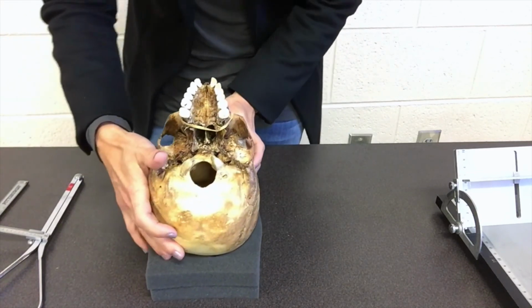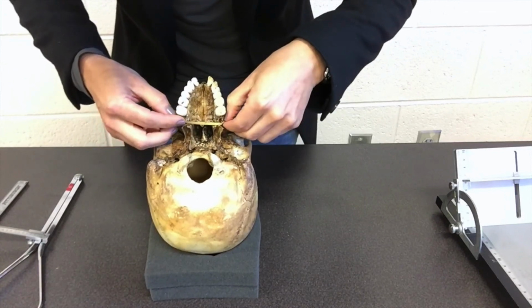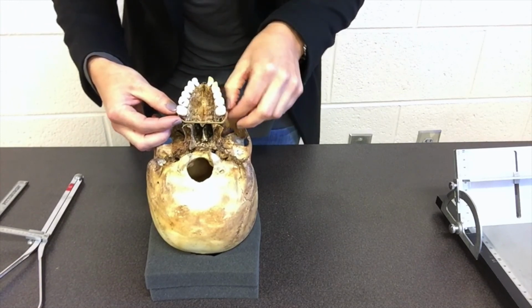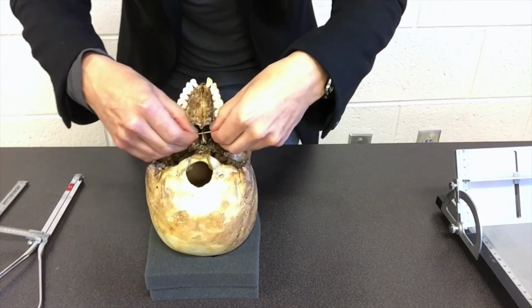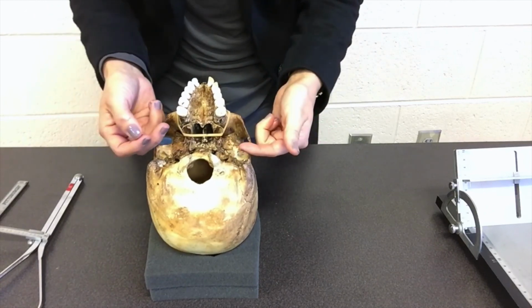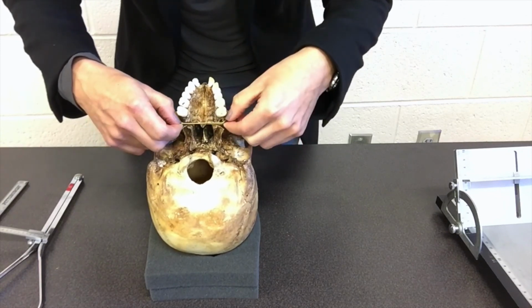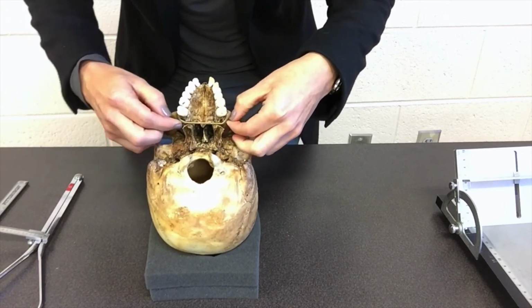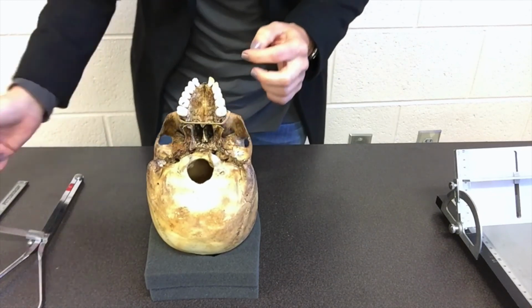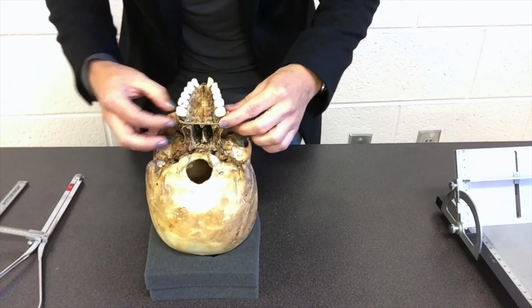And then the posterior portion of the rubber band is just going to come right across the back of the alveolar process, the distal portion. Now what's important is that you don't extend the rubber band as far as the pterygoid plates of the sphenoid. Okay, so you don't want to put it there or on the hamulus or anything. You want to make sure that you're just hugging the distal portion of the alveolar process of the maxilla.